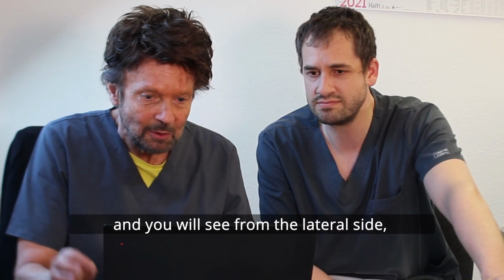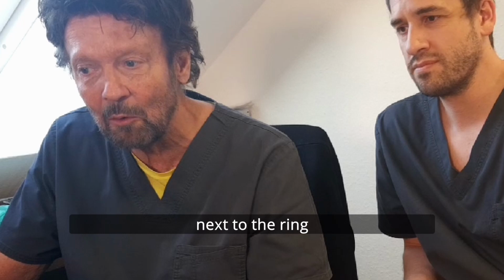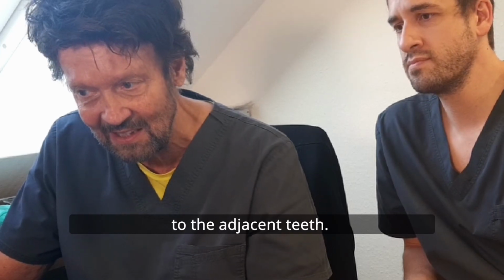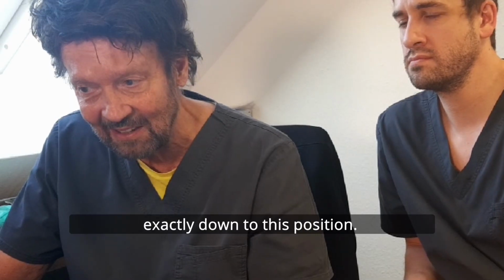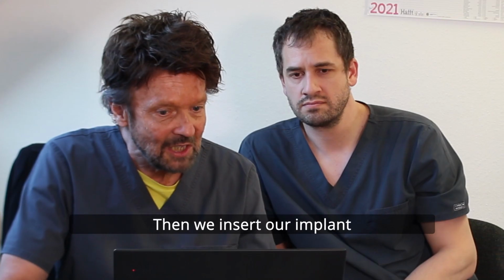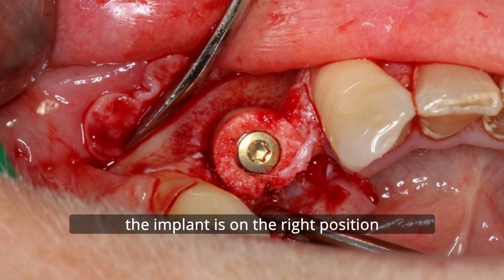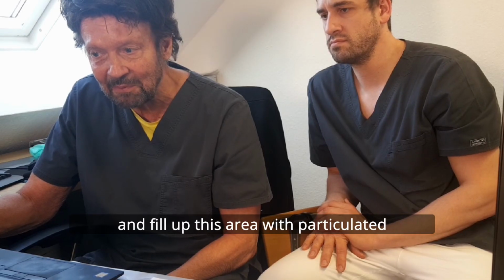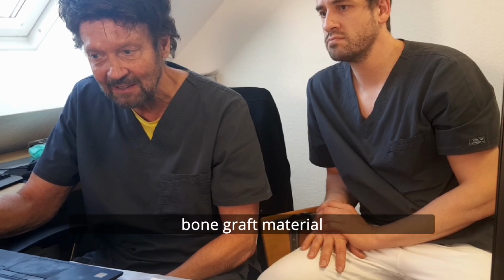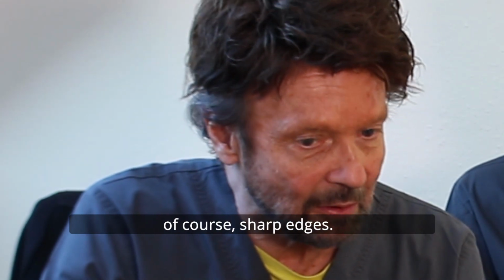And it's very important that the ring in the vertical position comes to the level of the bone next to the ring, to the adjacent teeth. Don't put the ring higher, because it gets resorbed exactly down to this position. Then we insert our implant through the ring into the local bone. The implant is in the right position, and then we fix a membrane and fill up this area with particulated bone graft material. This is our standard procedure. And before we do that, we remove, of course, sharp edges.